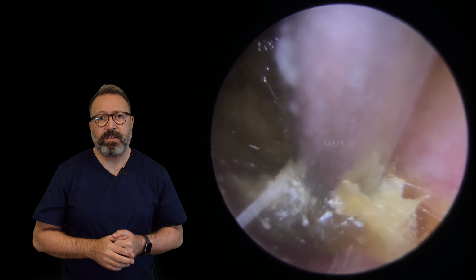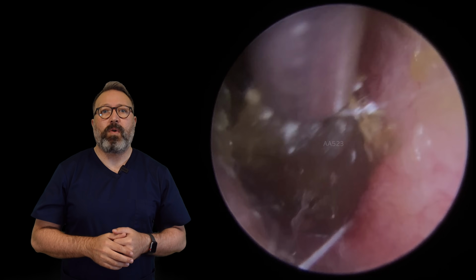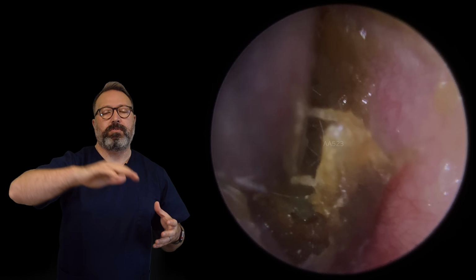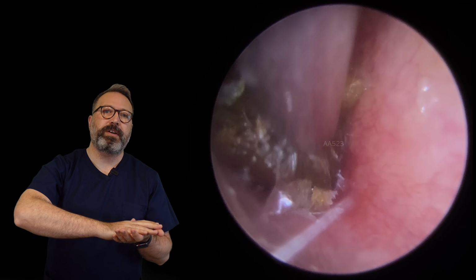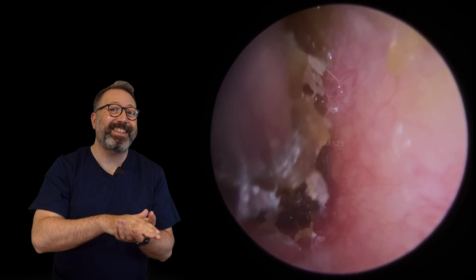To remove this, you're going to have this long front section here. When we peel this up, the olive oil can go back underneath. Wax will naturally want to go back to its first shape and form, if you like. So when you've got this long sloping front end to it like that, it naturally wants to settle back down. As soon as you take the suction away, it's just going to go back to where it was. If you put the olive oil in, when it does go back down, it doesn't stick there again then.